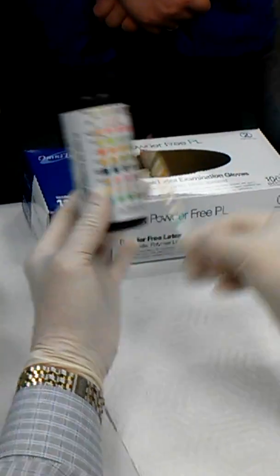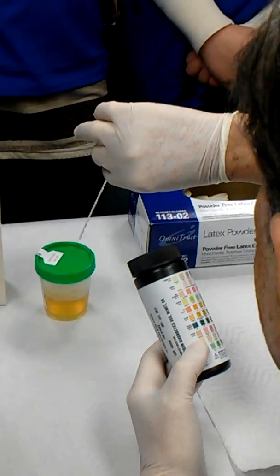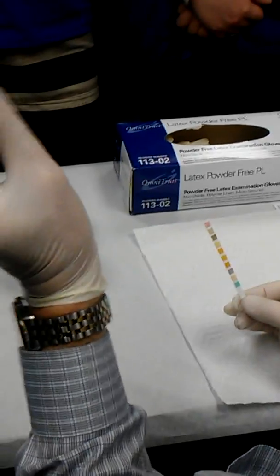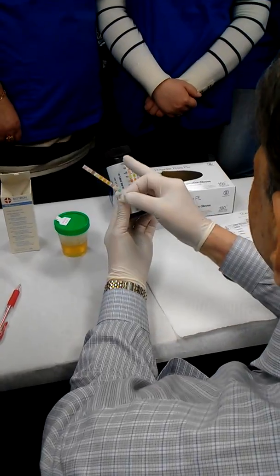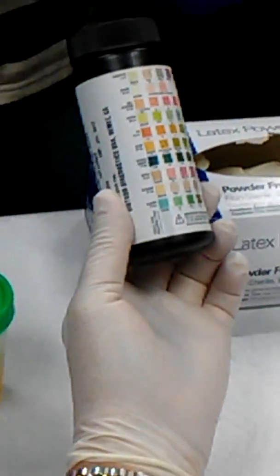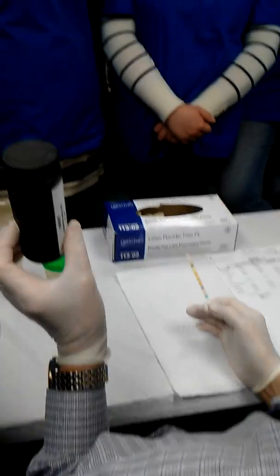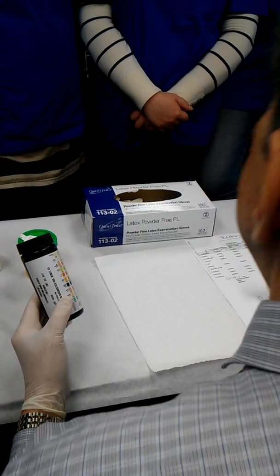You have to compare the color on the strip after placing the strips in the urine with the color on the bottle. You have different colors. You see these colors, right? The first row of the colors is normal urine, or control, right? And other colors are not normal, abnormal.